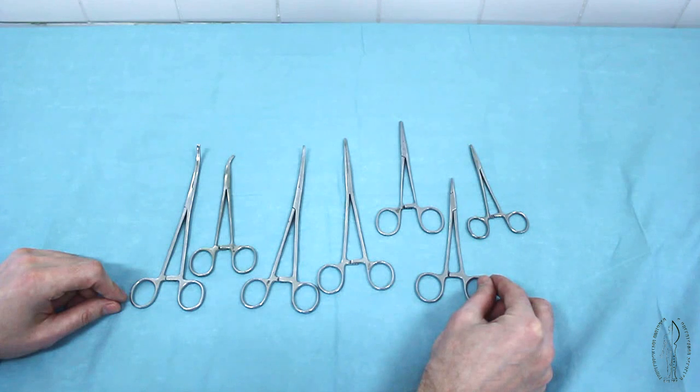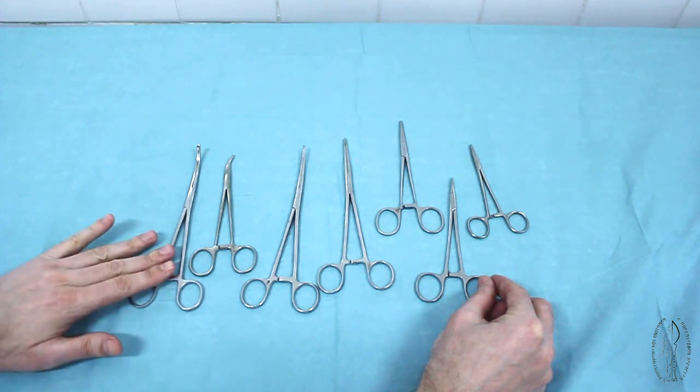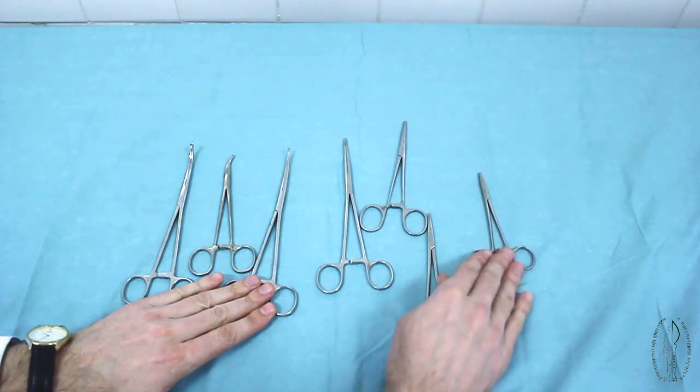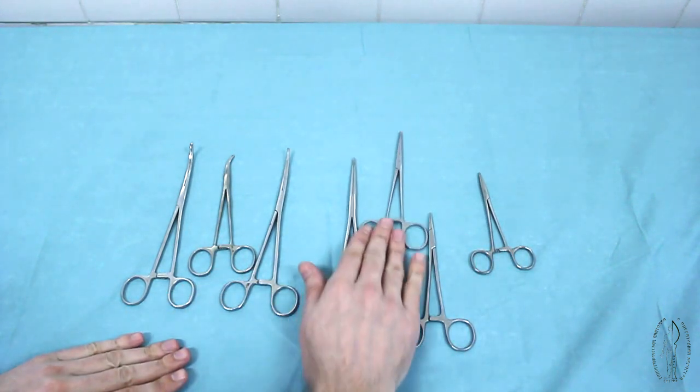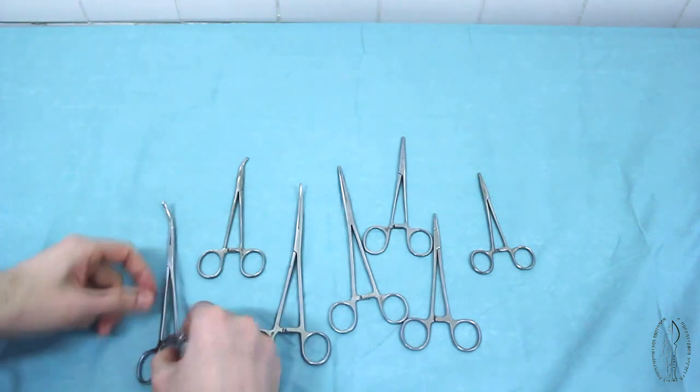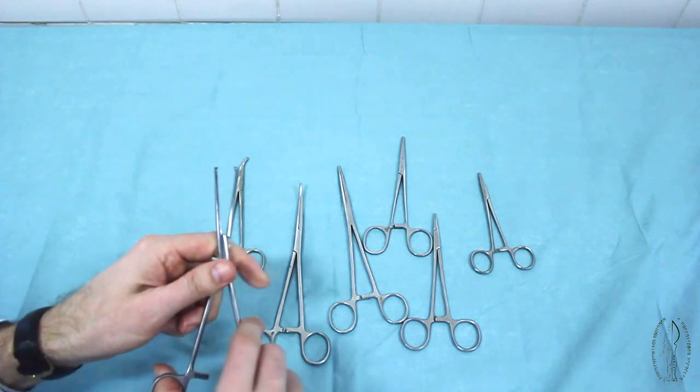Hemostatic instruments are used for control of bleeding from the vessels of soft tissues by their subsequent ligation, coagulation, or suturing. They are long or short, straight or curved, and can have teeth at the ends of their branches or be without them.